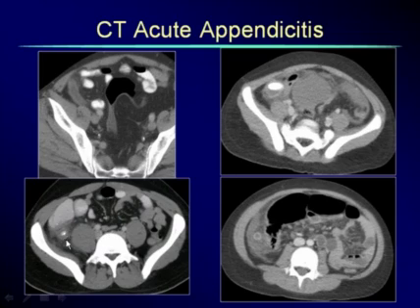Here's another appendicitis with edema surrounding the appendix and a little appendicolith. If we compress this abdomen, possibly we could see this. And here's a younger patient with an acute appendicitis and a lot of surrounding fat stranding. Again, compression leads us right into the appendix.